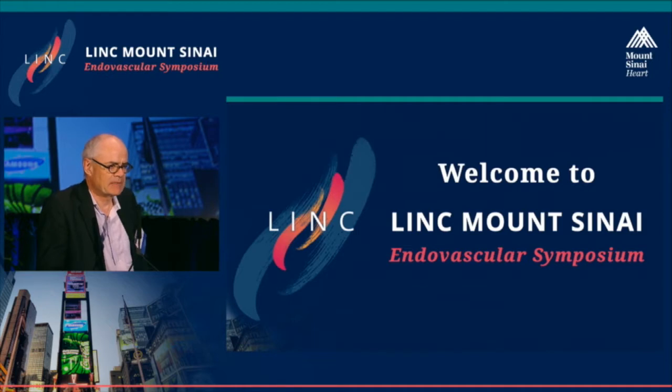And finally, if this would have ended as a subintimal procedure, I wouldn't have used lithoplasty. What we have learned so far is that the most efficient application is in the true lumen, so meaning staying concentric with this kind of treatment. So in a subintimal recanalization case here, the next step would have been most likely to use interwoven nitinol stents, the Supera stent, which has been shown to be very effective also in this popliteal location.